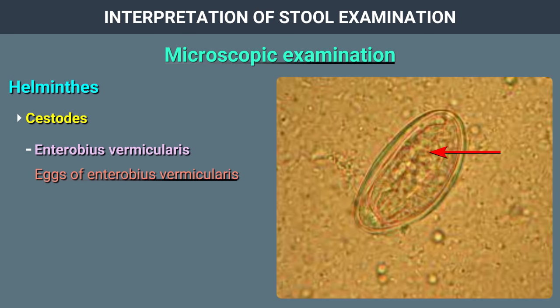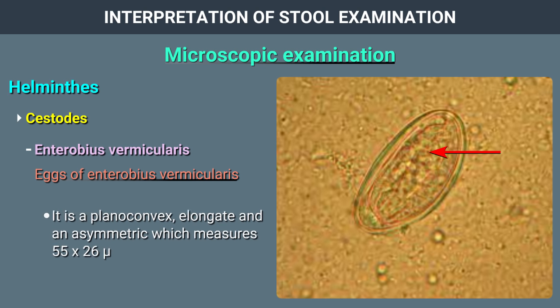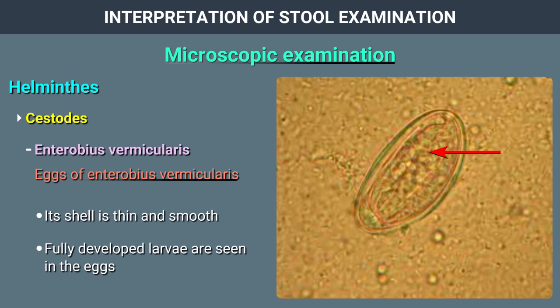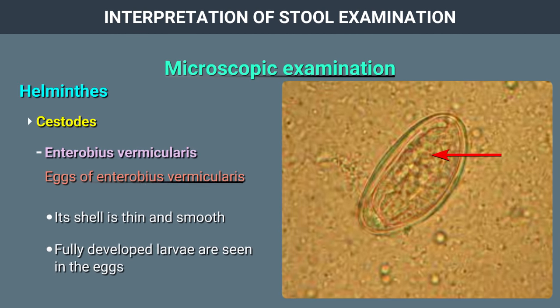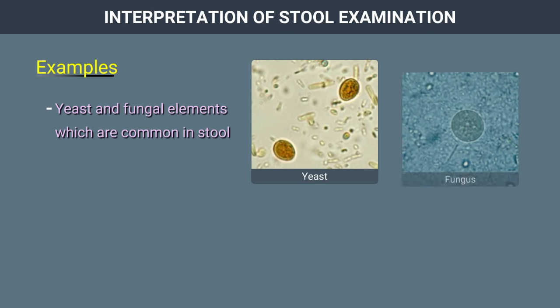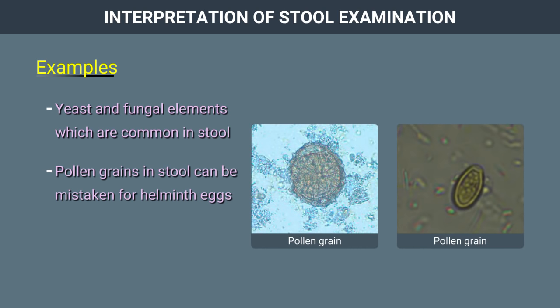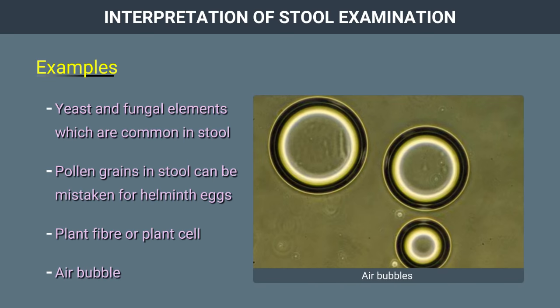Enterobius vermicularis: it is a plano-convex, elongate, and asymmetric egg measuring 55 by 26 microns. Its shell is thin and smooth, and fully developed larvae are seen in the eggs. It is important to recognize artifacts during stool microscopy as they can be confused with ova and cysts of various protozoa and helminths — for example, yeast and fungal elements which are common in stool, pollen grains which can be mistaken for helminth eggs, plant fibre or plant cells, air bubbles, etc.